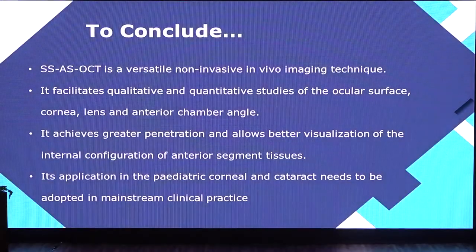I'll conclude by saying this Swept-source OCT is a very versatile, non-invasive, in vivo imaging technique, which achieves better penetration and visualization of the structures, and it should be more applied to pediatric corneal diseases as well.